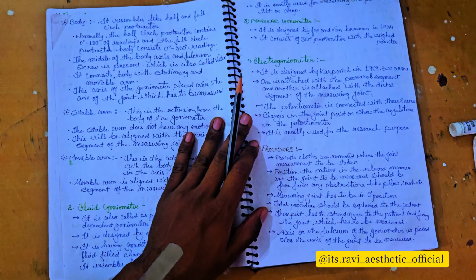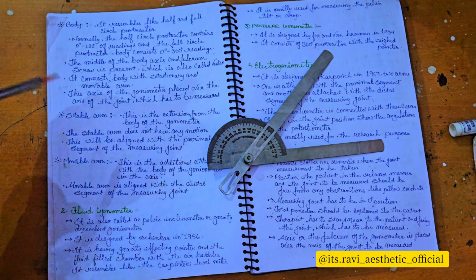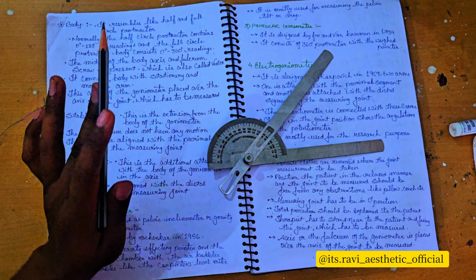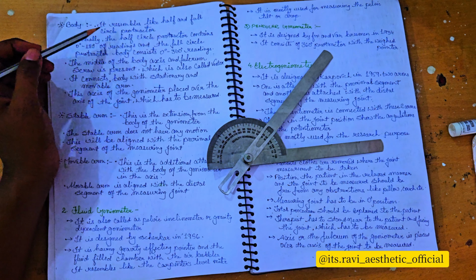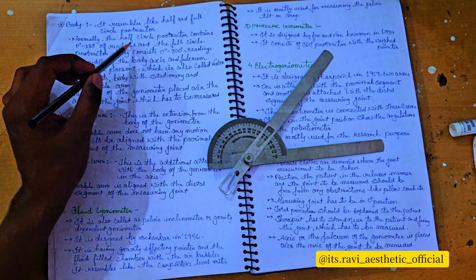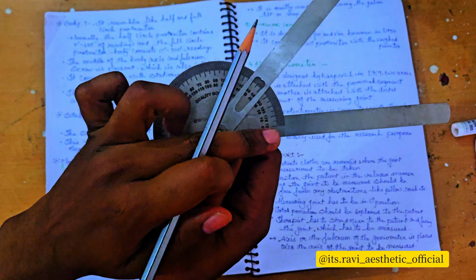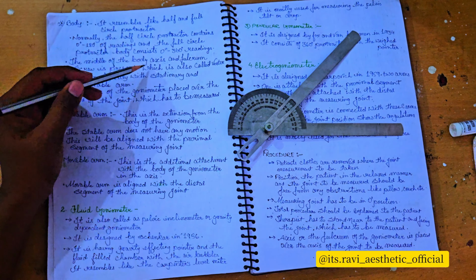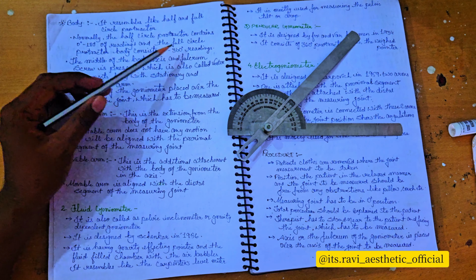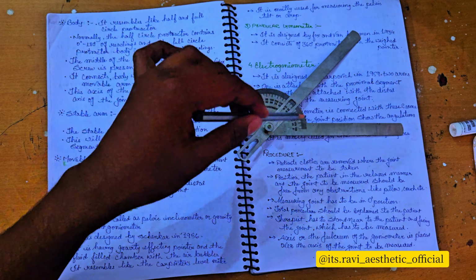Now we can go through each and every part of the goniometer in detail. So what is the body? The body is also called the protractor. It resembles a half moon and full moon circle protractor. So this is the half moon. Normally the half circle protractor contains 0 to 180 degrees. Here you can see 0 to 180 degrees are present. The body can also have 0 to 360 degree readings. It is a whole circle which is also available in goniometers.